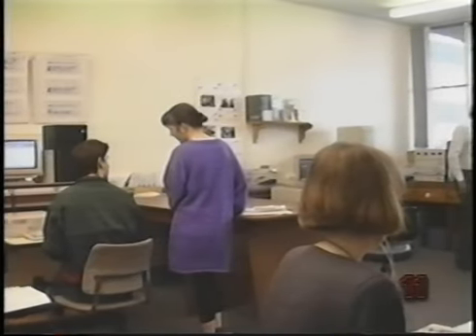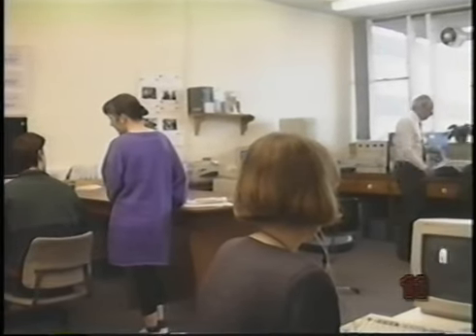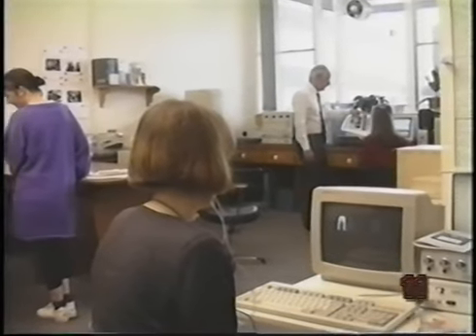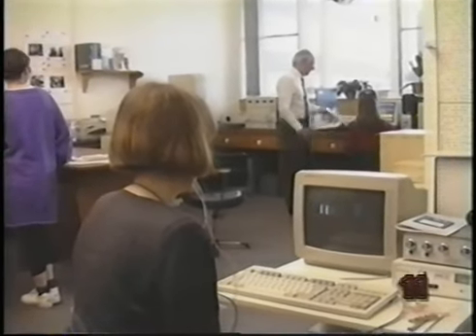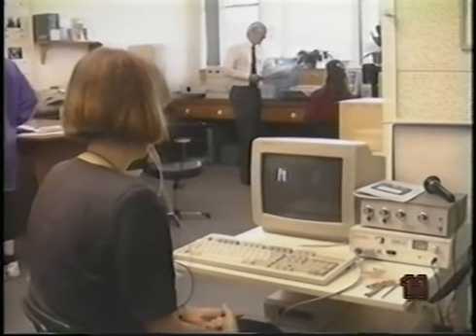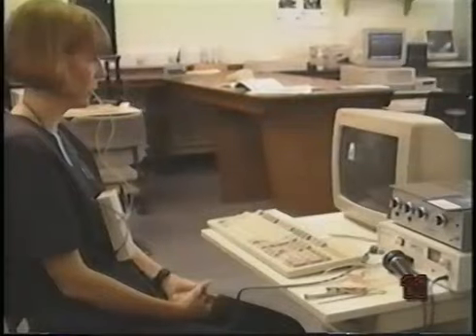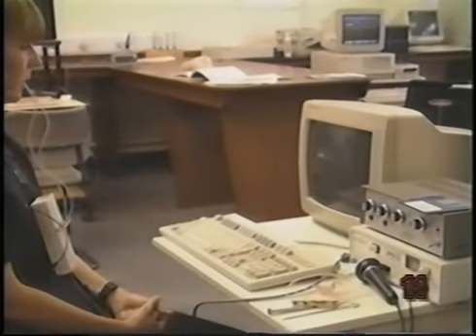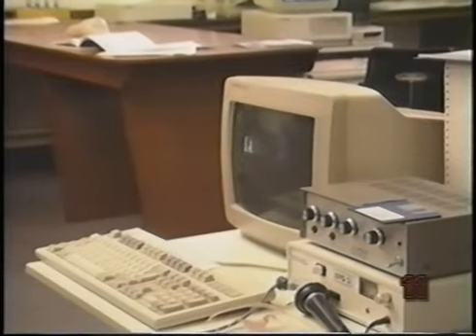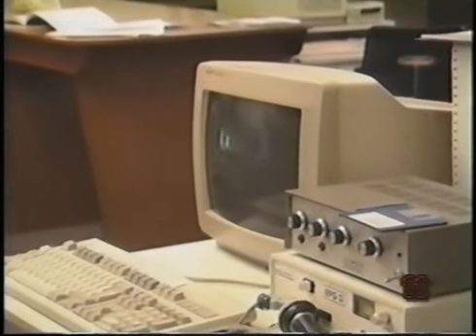The details of tongue movements during speech are of great interest to anyone involved in understanding the processes of speech communication, particularly phoneticians and speech and language pathologists. With electropalatography, or EPG for short, it's possible to record one important aspect of tongue activity: the location and timing of tongue contacts with the hard palate during connected speech.